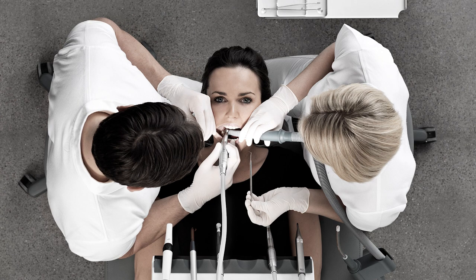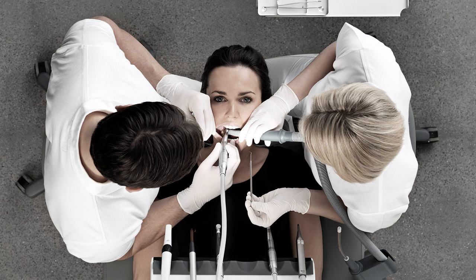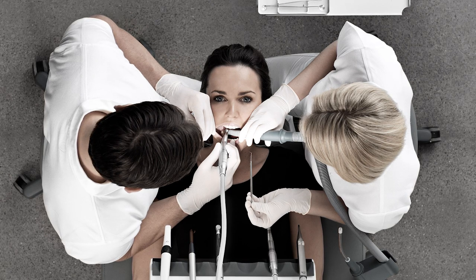Four-handed operation: here the operator is working in the 9 o'clock position, the chair side assistant in the 3 o'clock position, and the hand instruments are positioned near the patient's temple.